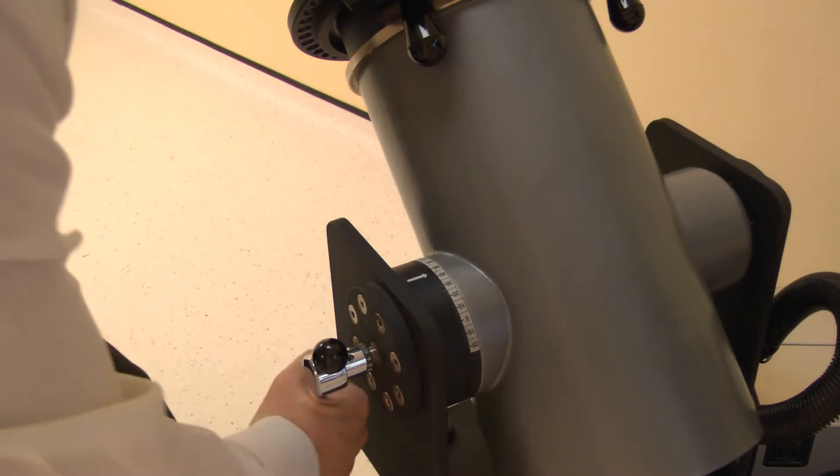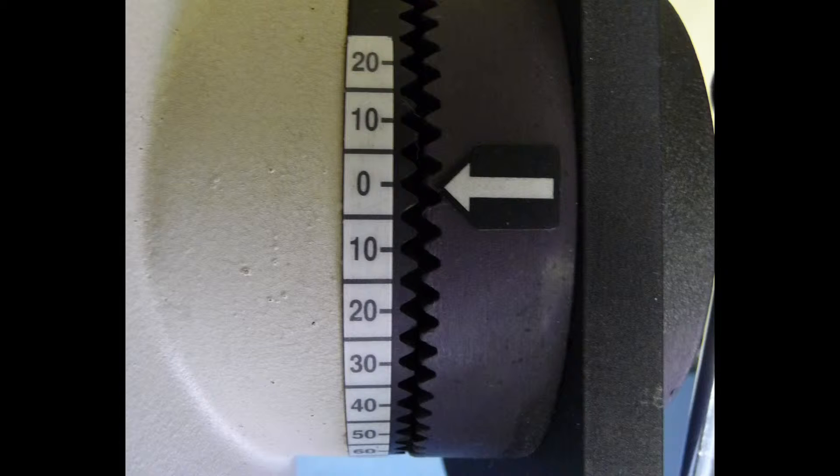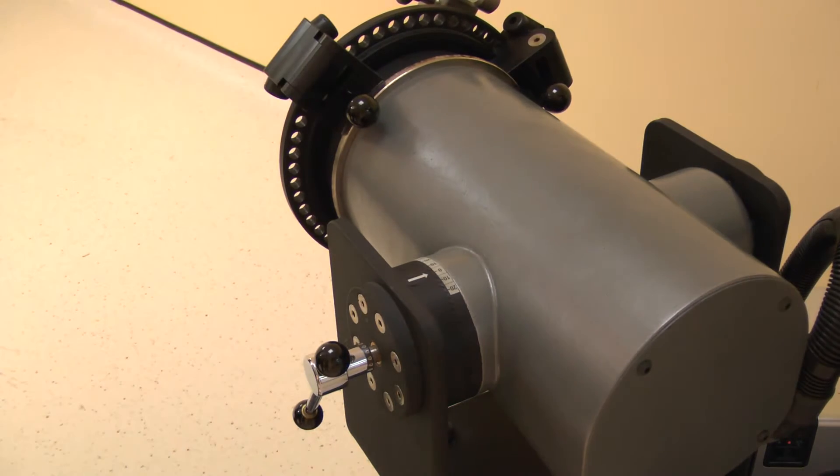Now set the dynamometer tilt. Release the locking handle then change. For the knee, adjust the tilt angle to 0 degrees. Lock by tightening the handle.